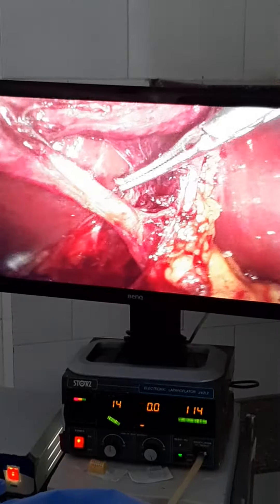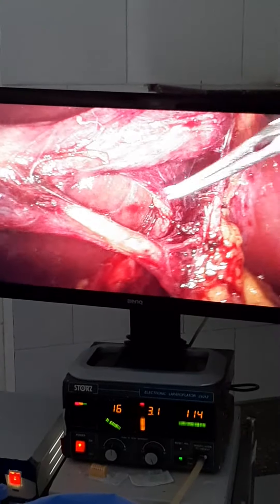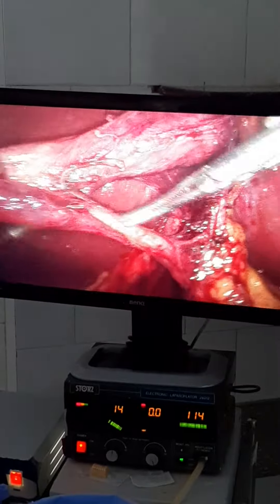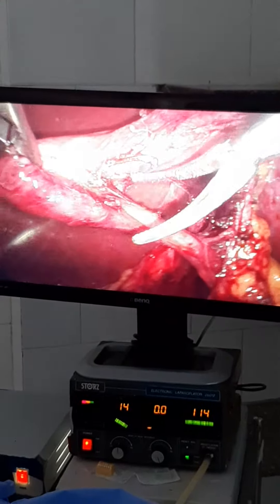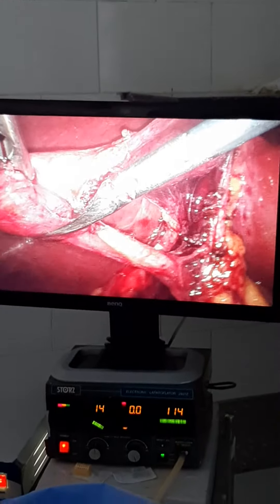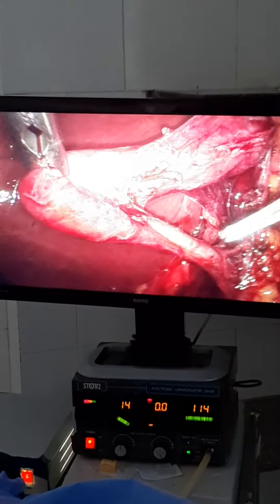This is a very long cystic duct. In cases of a very long cystic duct, I have to dissect the cystic duct properly for its full length to avoid long cystic duct stump and to avoid missing stones in the cystic duct.